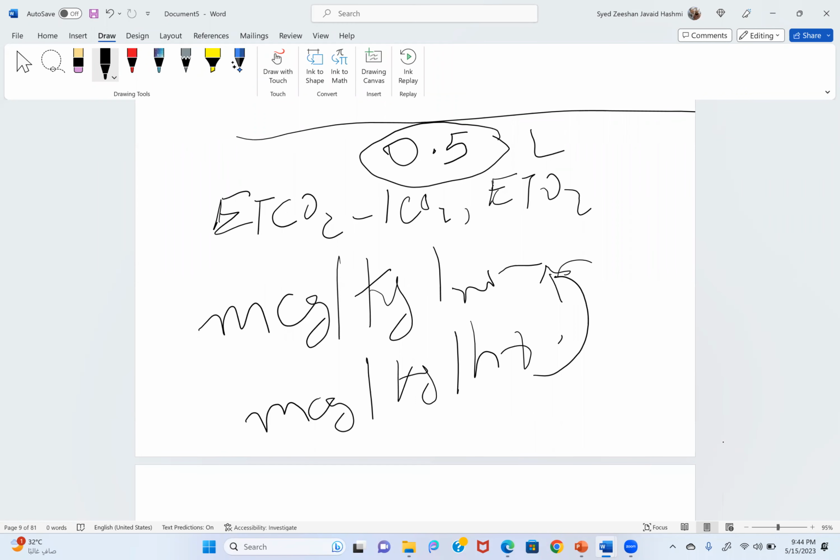Of course, nothing bad happened to the patient, but I'm just telling you that if you set a low volume to be infused, it is actually a sort of protection.